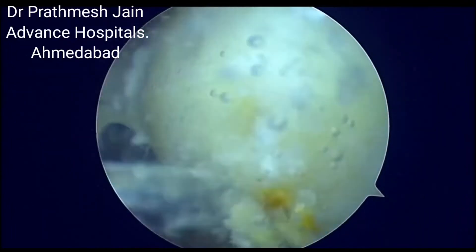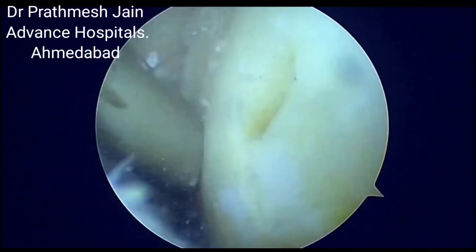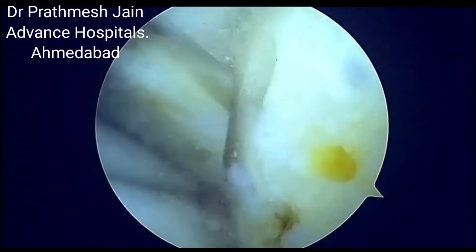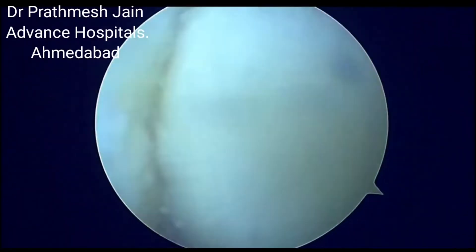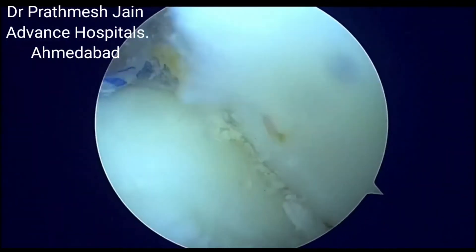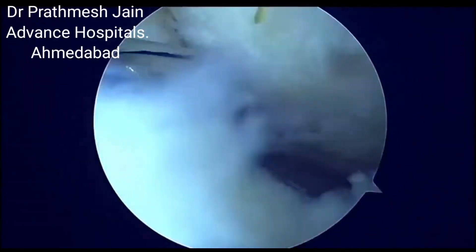This will help not only in relief of pain but also delay osteoarthritis in the future, thereby giving a very nice result. Fibrocartilage is actually not equivalent to hyaline cartilage, but will give good results if combined with a good meniscus repair, root repair, and extrusion repair.